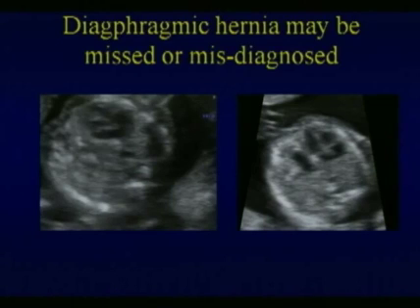there's other clues here, and that includes a little bit of fluid. Now, you certainly can get CCAMs with cystic lesions, but if you just stop and watch, you'll usually be able to see peristalsis. And sometimes we're so busy scanning, we forget to just stop and watch. If you just stop and observe, you'll usually see a little bit of peristalsis in this bowel, which is herniated up into the thorax.